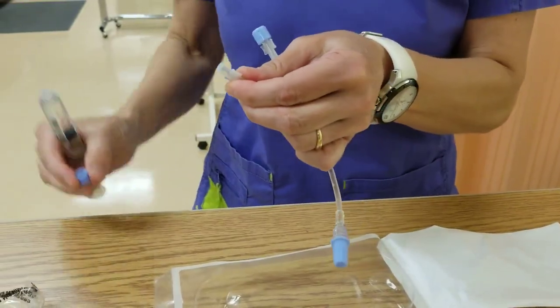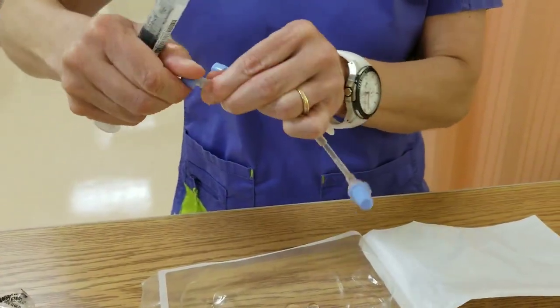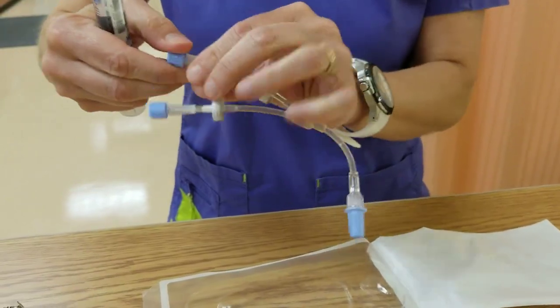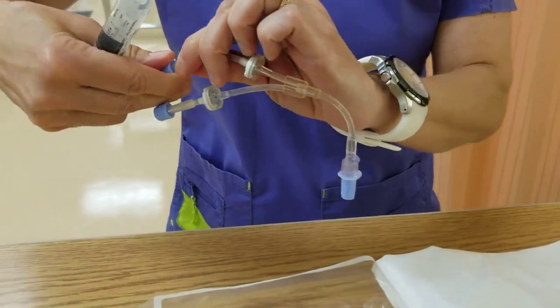Maintaining sterility and asepsis, I will cap that. And then there's only one more cap to flush.